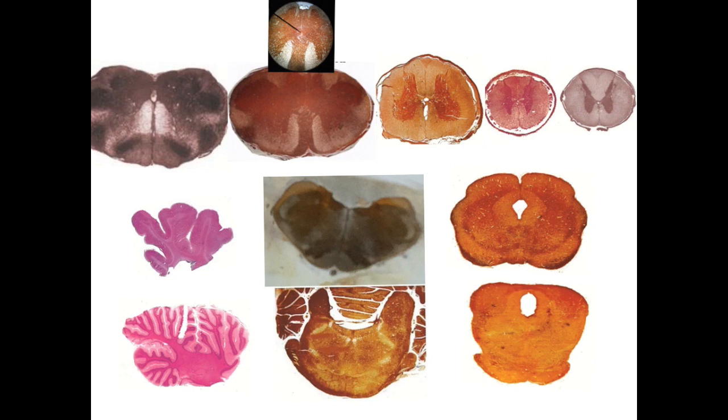First you look at the slide. If you see a central canal, then this slide belongs to the group of the spinal cord and closed medulla. If the H-shaped gray matter is present in front of you, then this is a spinal cord. If no H-shape, then this is a closed medulla. In case of the spinal cord, look at the posterior horns. If the posterior and anterior horns are thick and look like a half boot, this is the spinal cord lumbar.